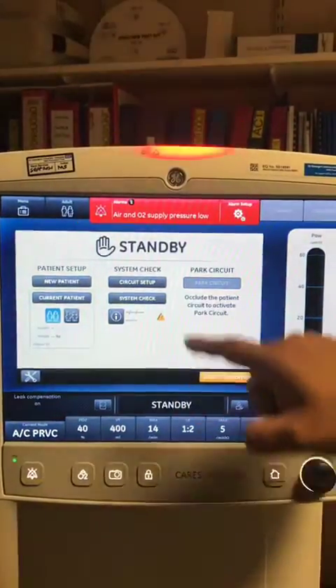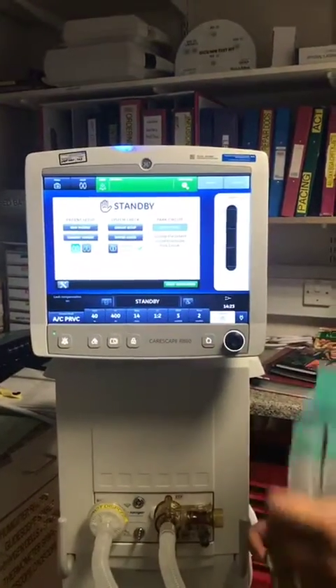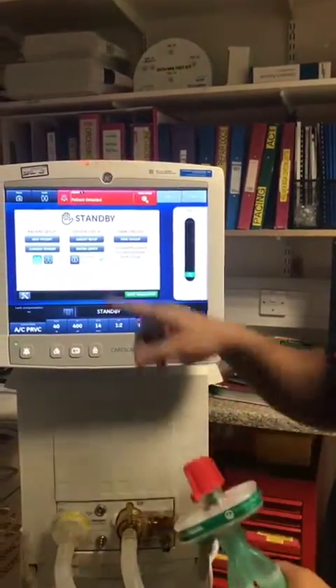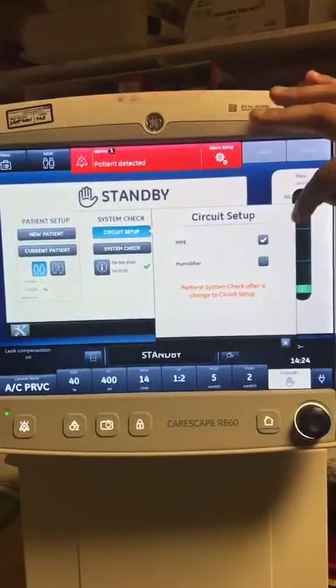Once you've done that, the system check lights up. When you get the patient circuit, make sure that you put a HME on the red bung. If you go to circuit setup, it will say HME included.